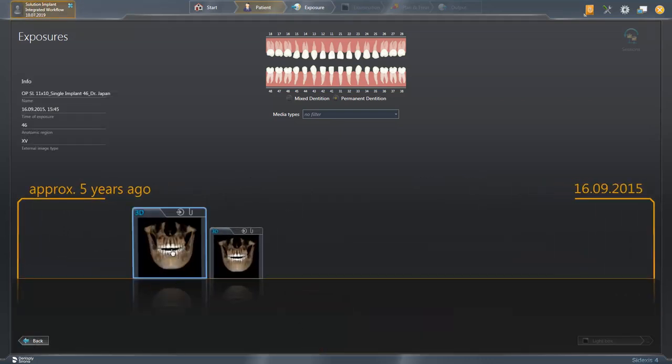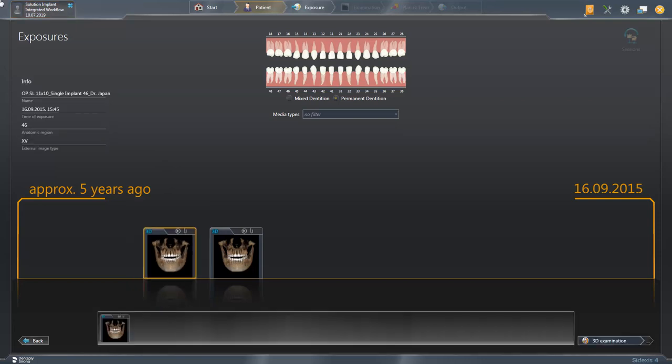We scroll to the 3D volume that we want to export and drag and drop it to the clipboard. Tapping on 3D Examination opens the selected 3D volume.